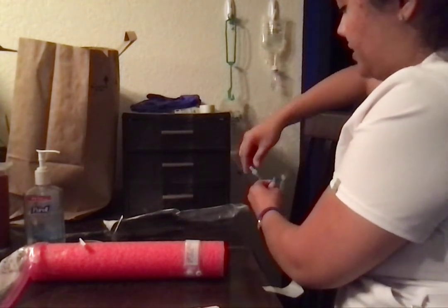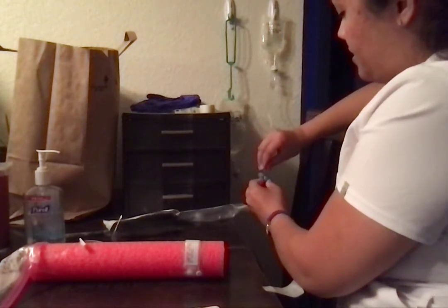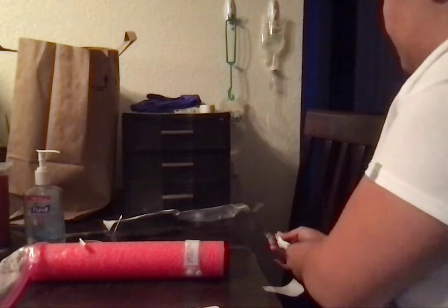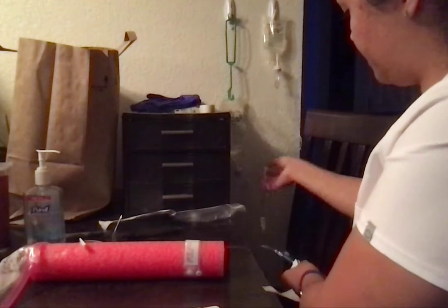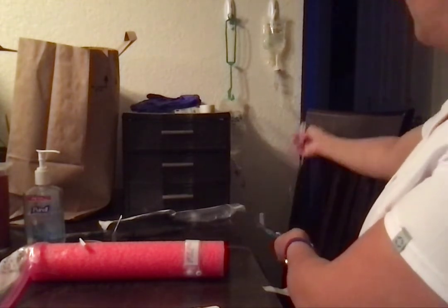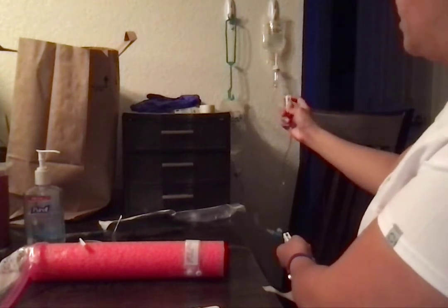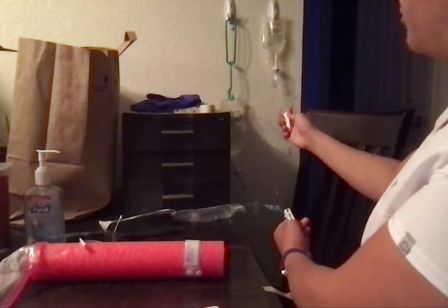And then making sure to not touch that, we're going to unscrew the secondary line, connect that. Okay, so that looks all good. Make sure that they're both clamped. And then we are going to fully open the secondary line. The bottom one is still clamped, because the one closest to the patient is the one that's going to maintain the drip rate.